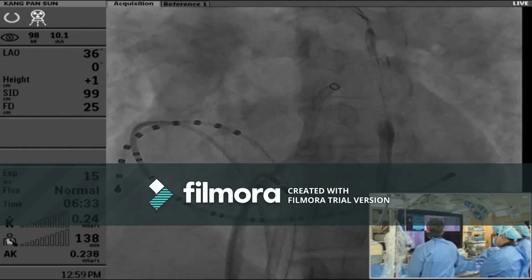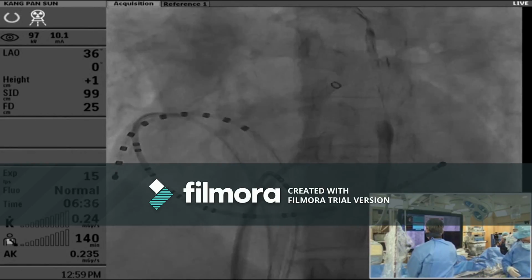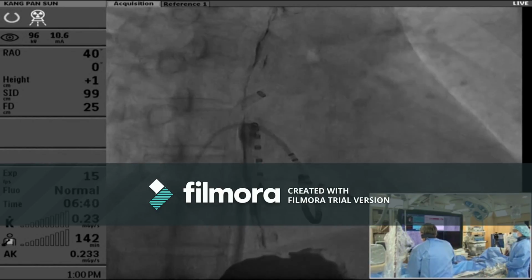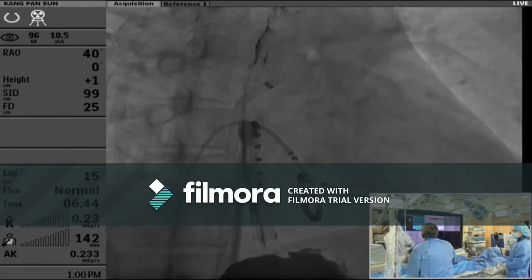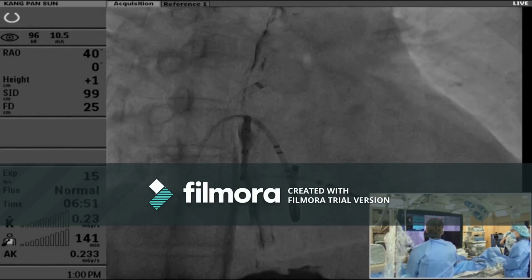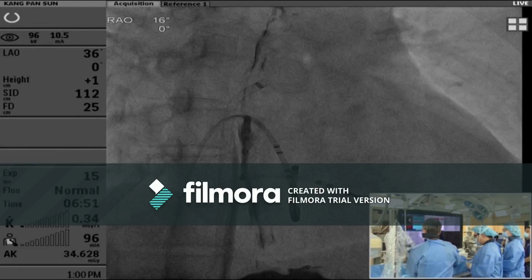The jump is not obvious. I already inserted like this.